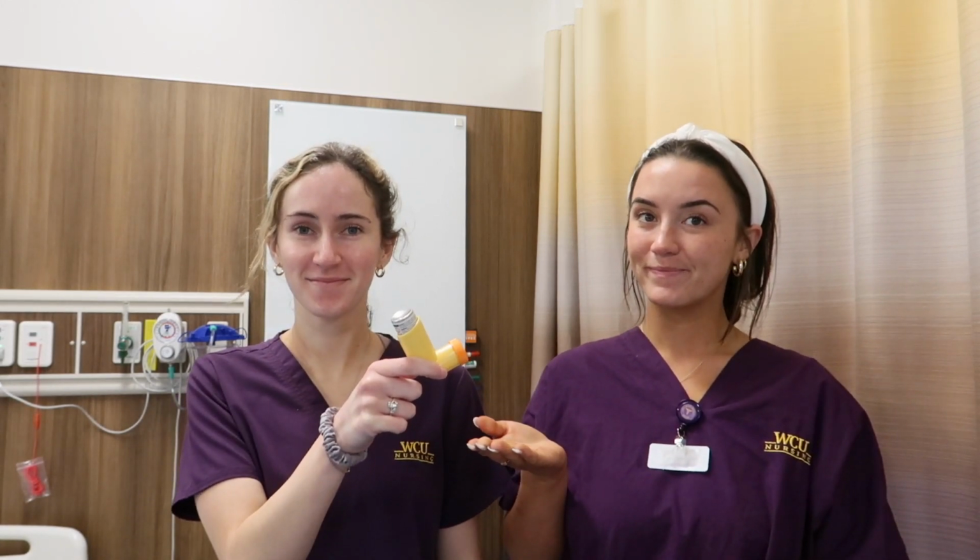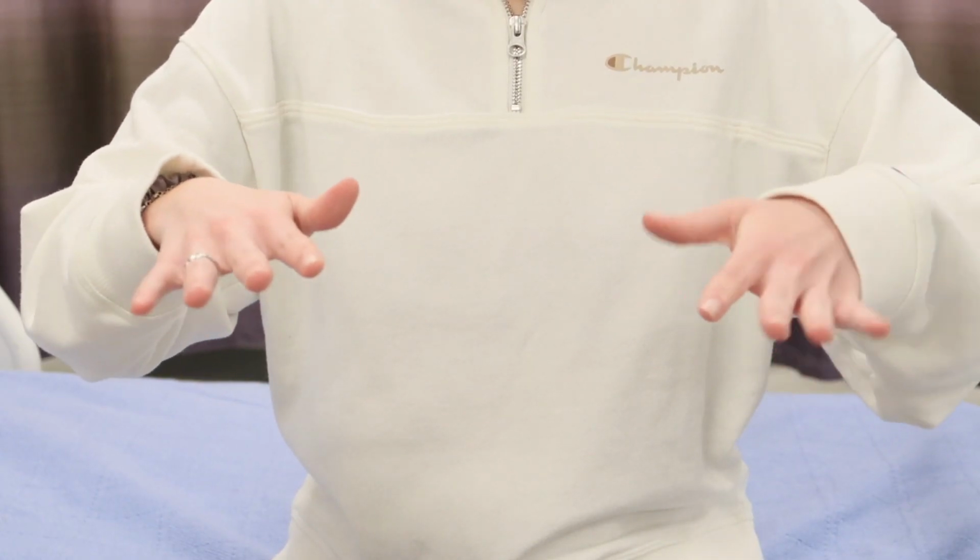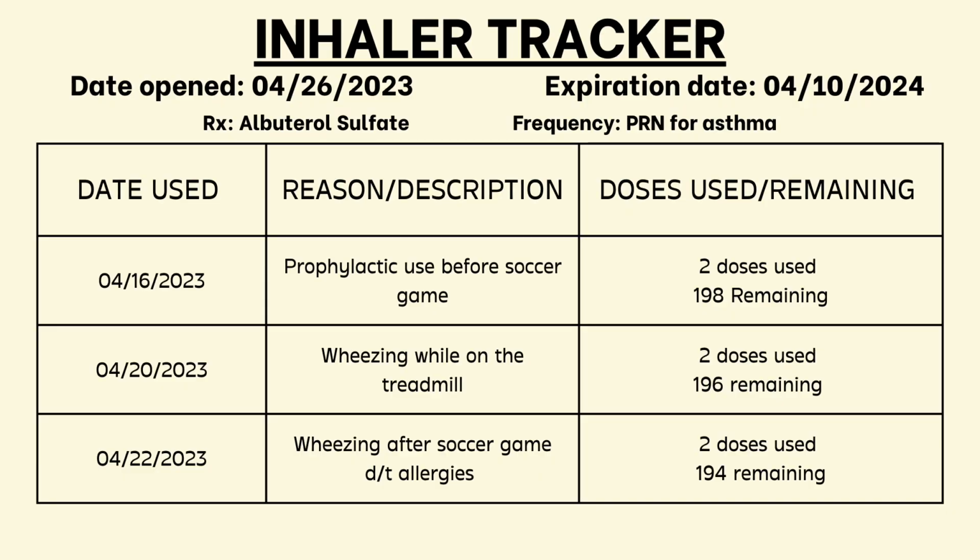One example of a medication used to treat wheezing and rhonchi is albuterol sulfate, which is a bronchodilator. Albuterol sulfate can be nebulized or can be inhaled through a metered-dose inhaler, which may look something like this. Common side effects are chest pain, palpitations, tremors, nervousness, and restlessness, so monitor these after administration. It is important to not exceed prescribed dosages and adhere to the dosing schedule of either a fixed schedule or the use of the bronchodilator as needed.